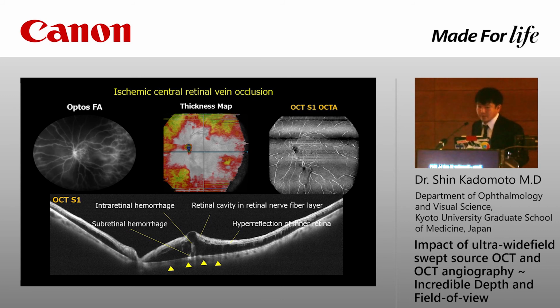without using fluorescein angiography. If we scan this case with SD-OCT, the spectral domain OCT, in ischemic CRVO, marked signal attenuation occurs because of the severe retinal ischemia. However, the ultra-widefield swept source OCT can visualize the choroid-scleral interface and peripheral macular edema.